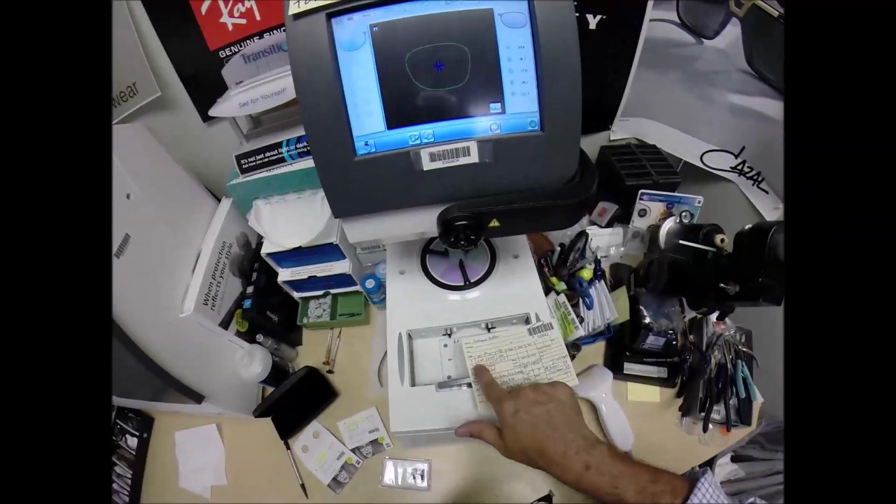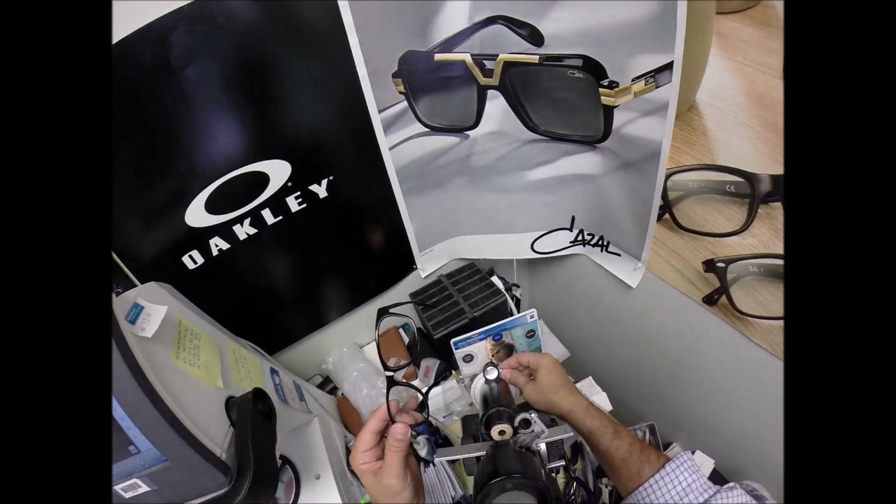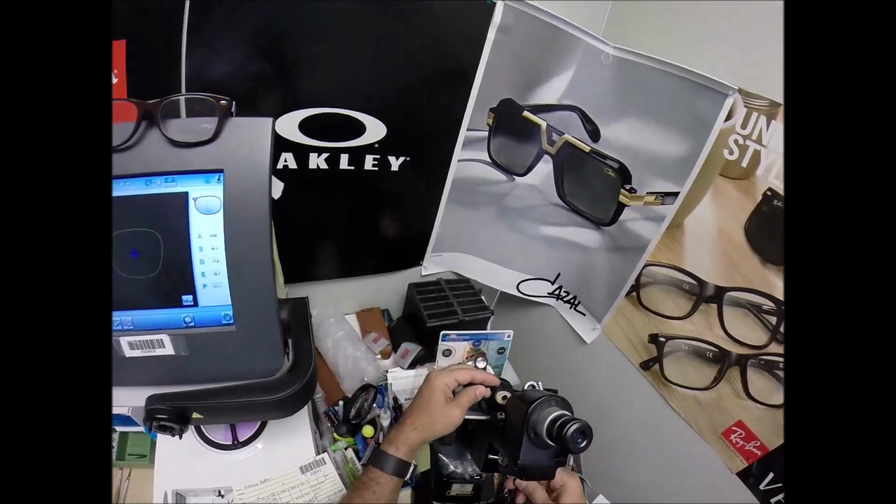So again, my prescription reads +1 minus a quarter at 136. I'm going to turn the axis wheel to 136. Put the lens in just above that black dot.